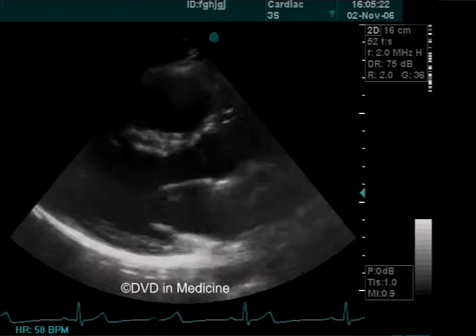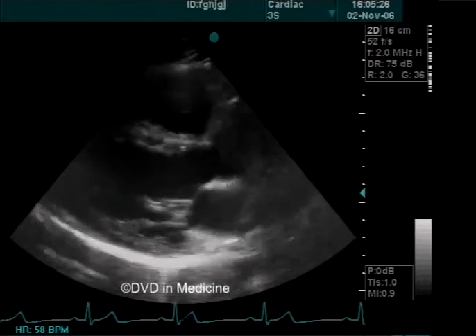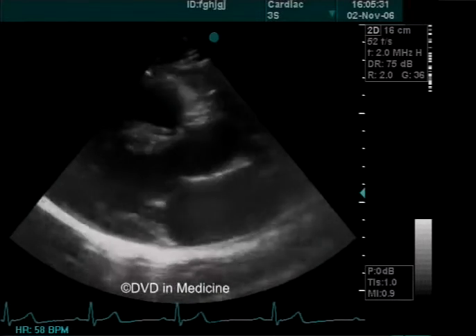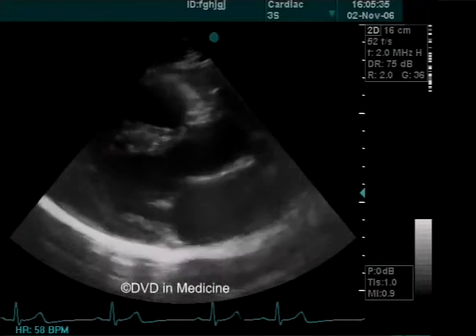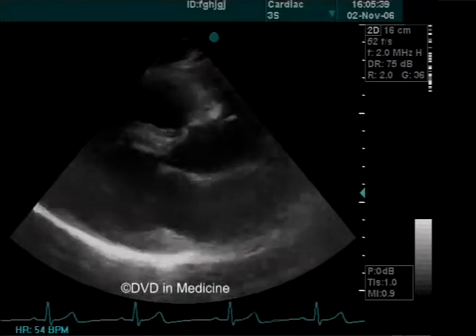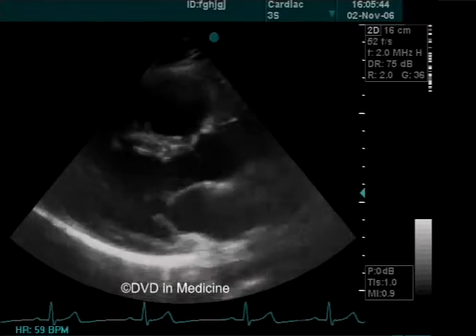8. To diagnose structural changes and dysfunctions of the mitral valve and its supporting structures, cords, papillary muscles. 9. To diagnose coronary sinus dilation. This can be evidence of persistent left superior vena cava. 10. To assess the left atrium and to diagnose masses inside it, thrombus, myxoma, membrane.